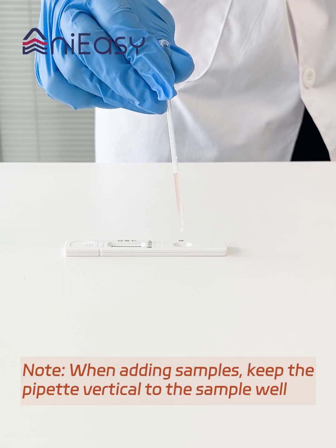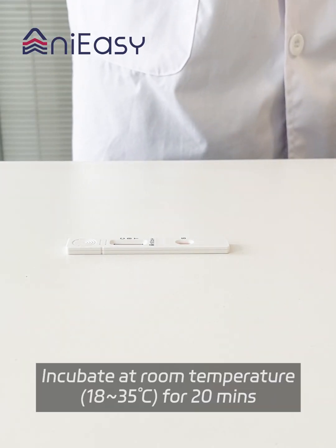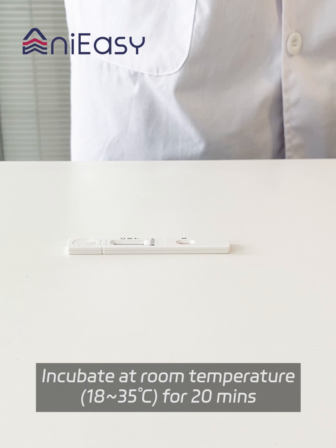Note: when adding samples, keep the pipette vertical to the sample well. Incubate at room temperature, 18 to 35 degrees Celsius, for 20 minutes.